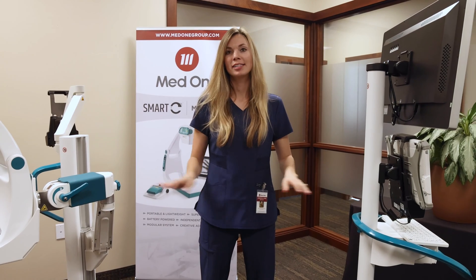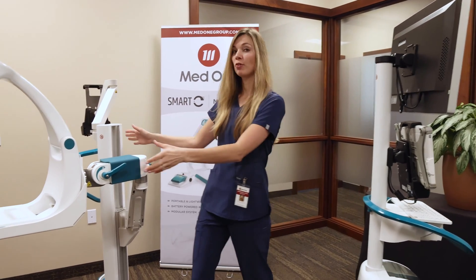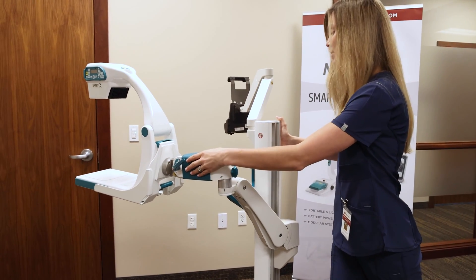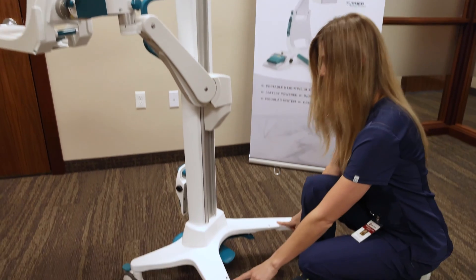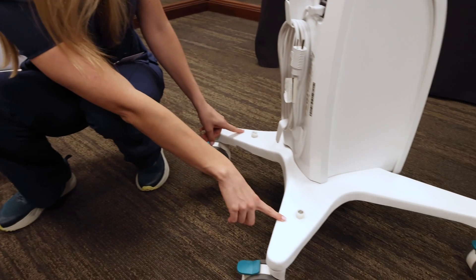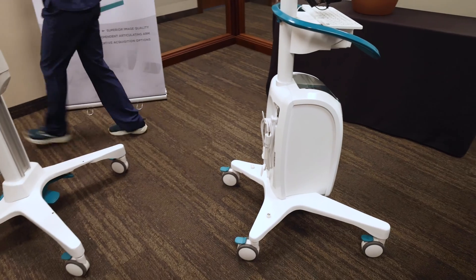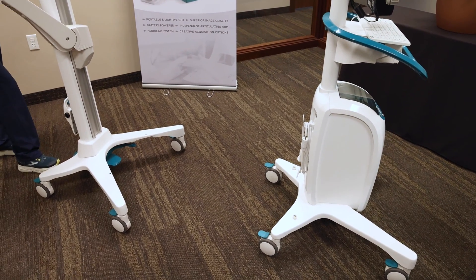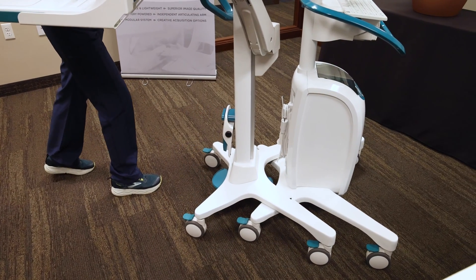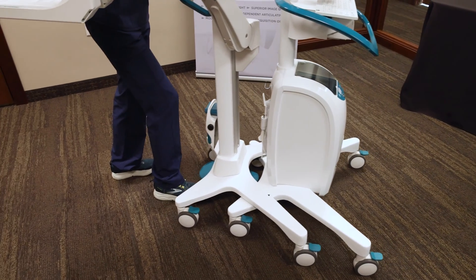The monitor cart and support stand fit together for easy movement and small storage footprint. First, move your Smart-C out of the way by positioning it towards the handle of the support stand. Next, look for the arrows on the front of your support stand and line those up with the alignment pins on the back of the monitor cart. Taking the handle of the support stand, push it forward until the two latch into place. Now you can easily move the system wherever it needs to go.